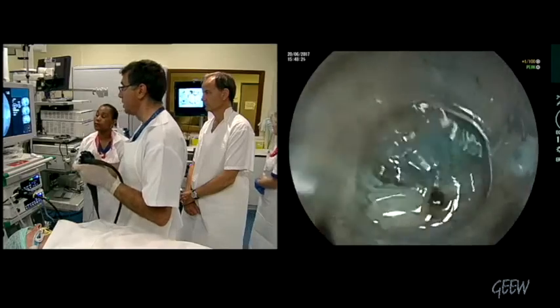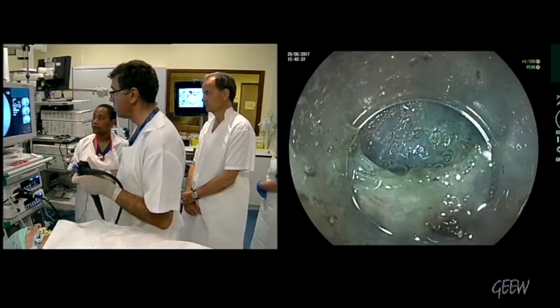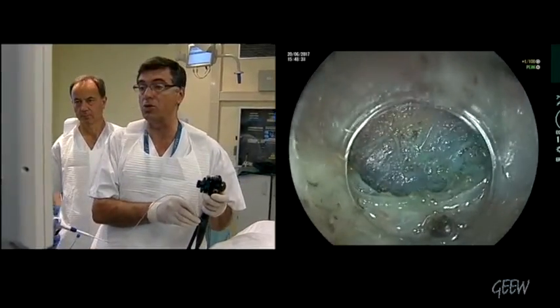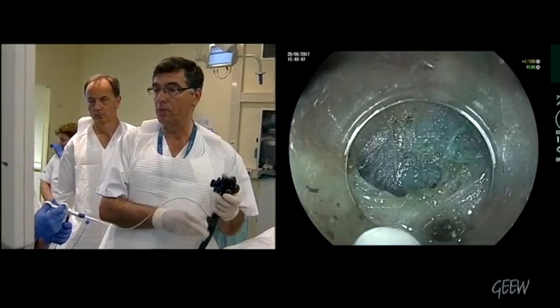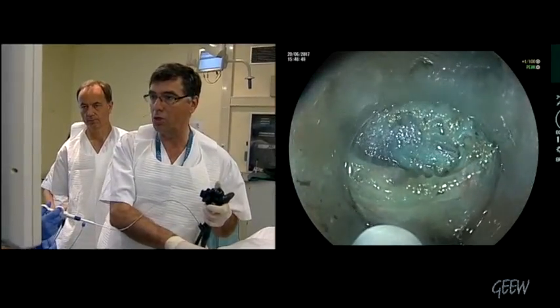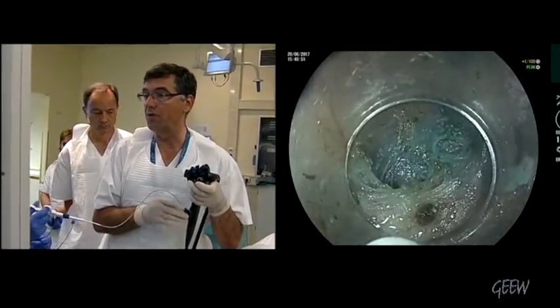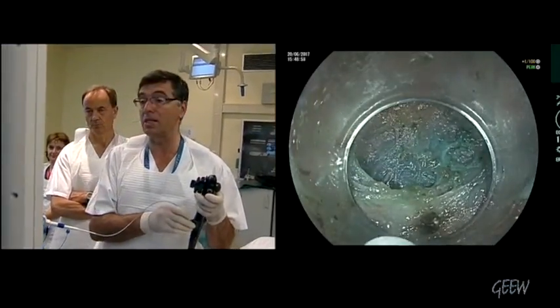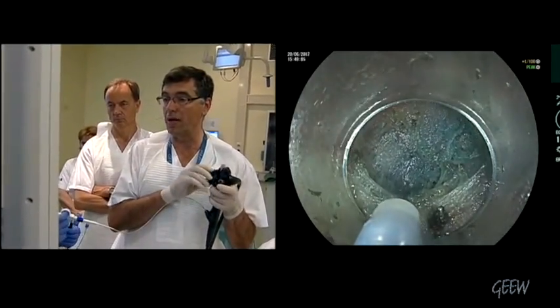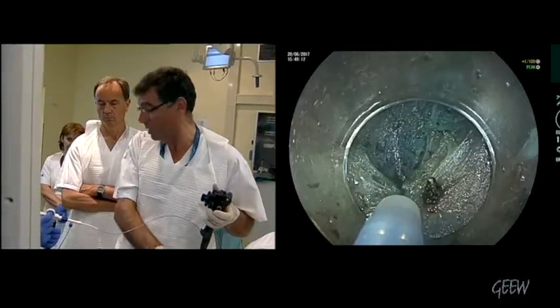You have to avoid any injury in this place, because any injury to the mucosa behind the pyloric arch — you see the pyloric arch? — if you do any injury behind, you have a mucosal perforation, and this is a disaster because you can have peritonitis. The pyloric arch is not so thick. It's better to do the myotomy and pylorotomy in a retrograde fashion, to avoid any contact with the submucosa and mucosa into the bulb.